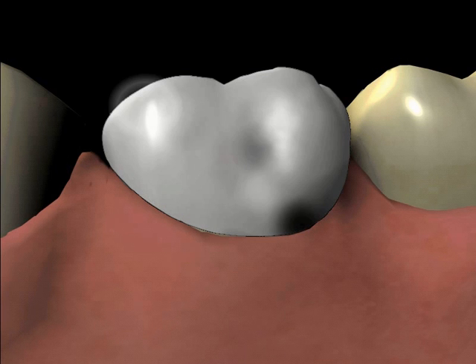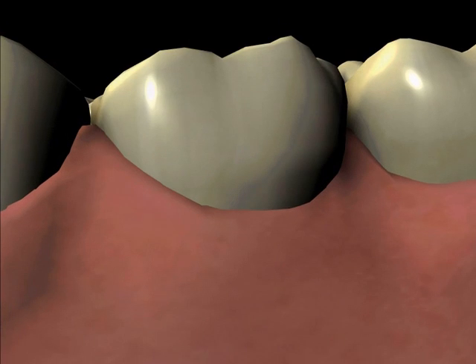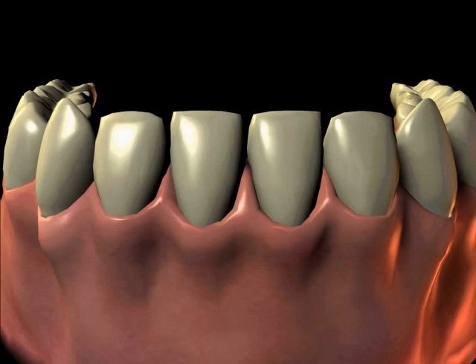The second stage appointment is for the placement of the crown restoration. Between the first and second stage appointments, precise fabrication techniques are used to make the crown exactly as is best suited for the reconstruction of the missing tooth structure.